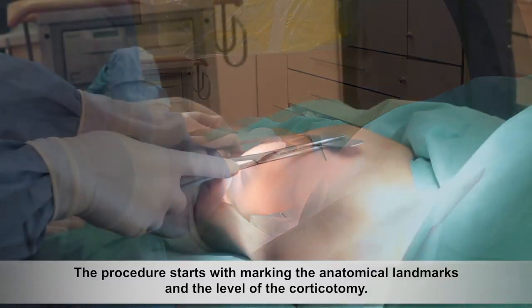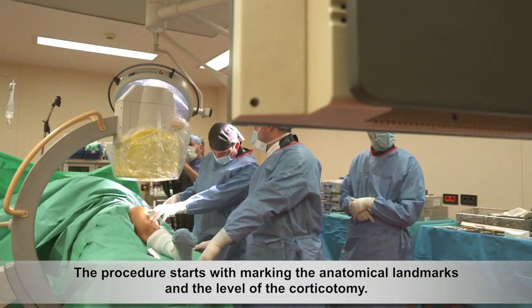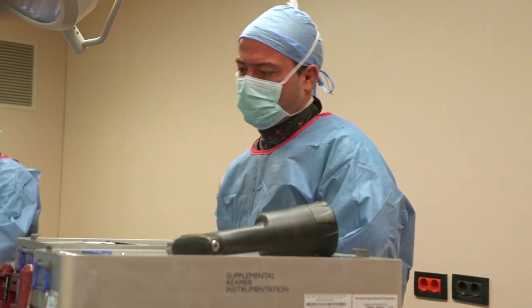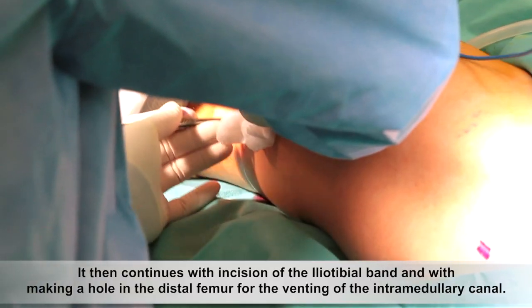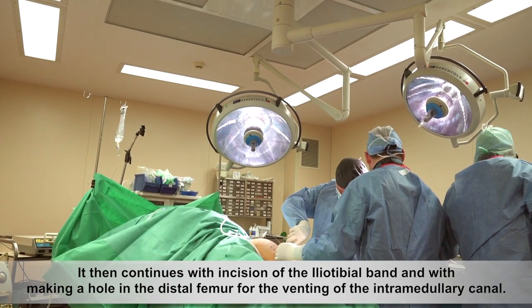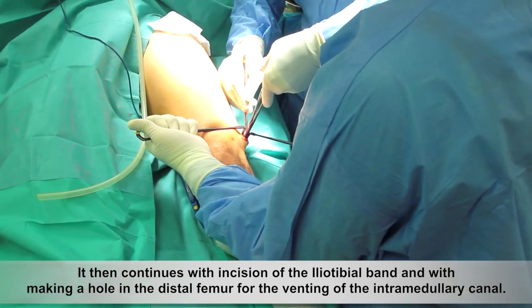The procedure starts with marking the anatomical landmarks and the level of their corticotomy. It then continues with incision of the iliotibial band and with making a hole in the distal femur for the venting of the intramedullary canal.